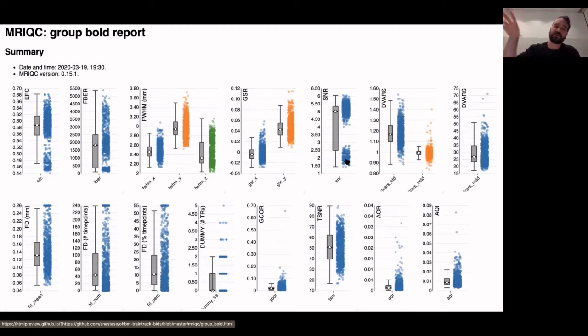All of this information is also represented in TSV files in tabular format, so you can really do whatever kind of analysis. This is just their built-in visualization of this, but you can do whatever sorts of analyses that you want here. So this provides you a lot of quality control metrics. And I am not exaggerating when I say that it is one line of code where you just point to the BIDS directory and say, give me subject one or give me the group or something like that. And it does all of this and generates that for you just based on the BIDS metadata.